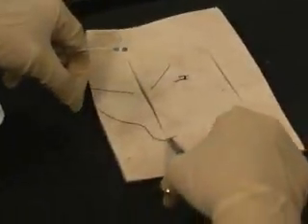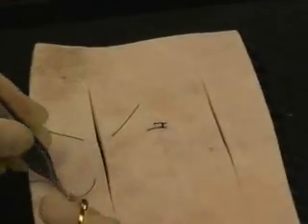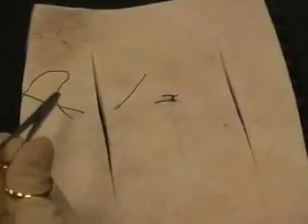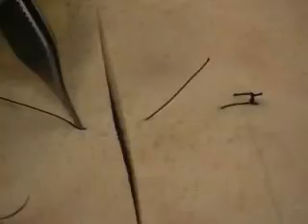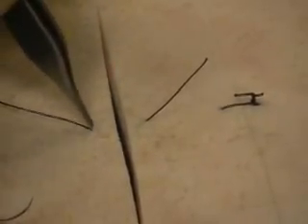We're going to go ahead and load up backhand again. So we need to load up with the smiley face going toward the right. And we're going to be fairly far back toward the, again, this part is called the swedge or the swage. And we're going to go backhand. That might be a little too far back for me. What we're going to do is go next door. So what I mean by that is before, this was a simple interrupted. If we stopped here, we'd be done. If we continued with the vertical mattress, we'd go near, near. But what we're going to do is go next door and come out. So it's going to look like a square, almost like a box.